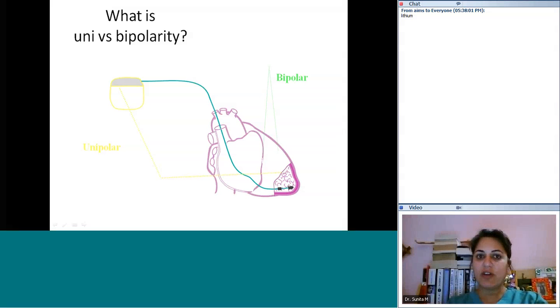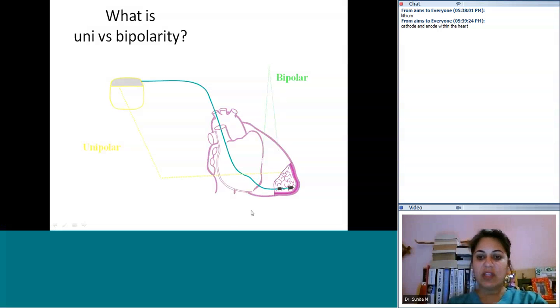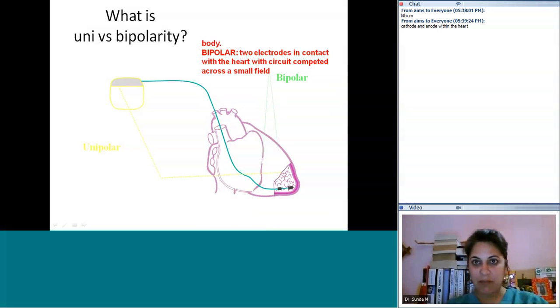Now next question is, what is unipolar versus bipolar? When we talk about a unipolar pacemaker versus a bipolar, what do we mean? What do we mean by unipolar? What do we mean by bipolar? Okay, so within the heart would be which one? So you mean bipolar in that.